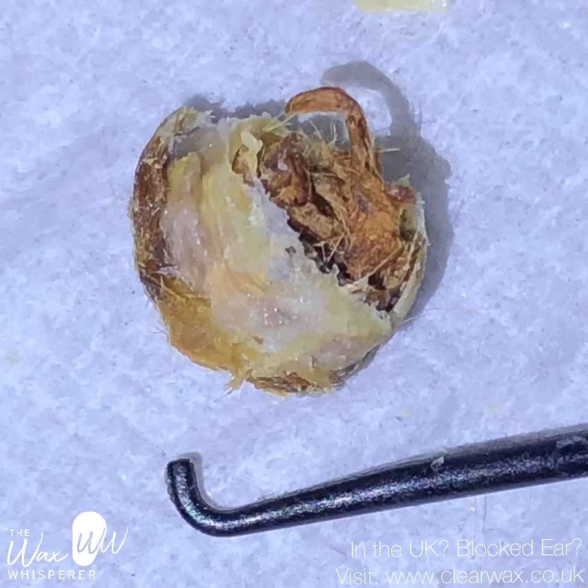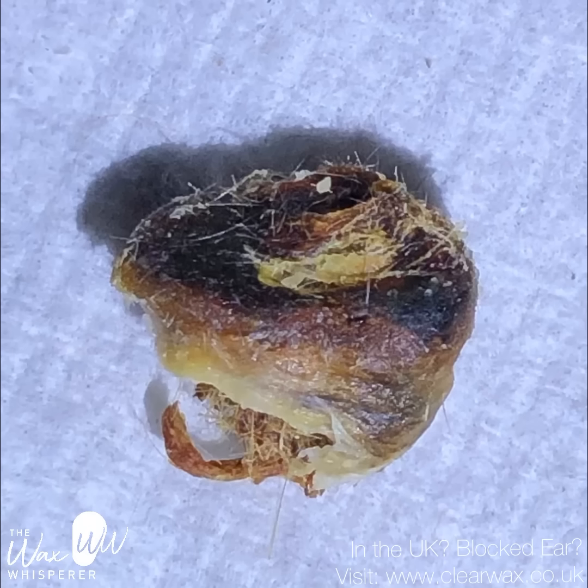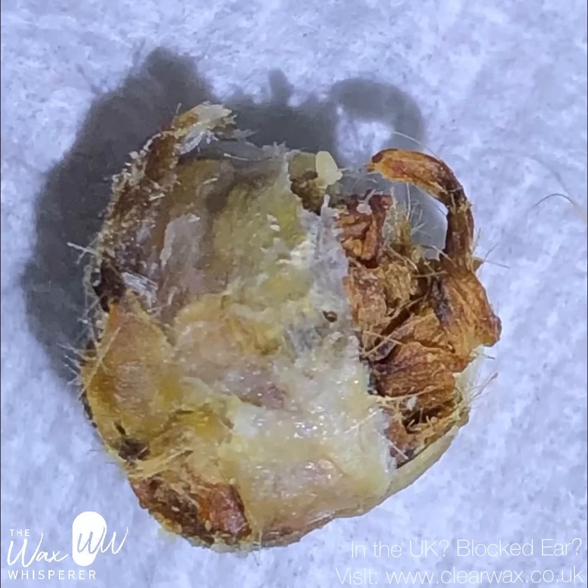You can see all the dead keratin and the core, the structure, and it's enveloped by a fresh layer of skin and some lipids, some saturated lipids there that are secreted by the glands within the ear. And again, you've just got another image there, a bit more of a close-up image. And we're going to proceed to patient 3 now.